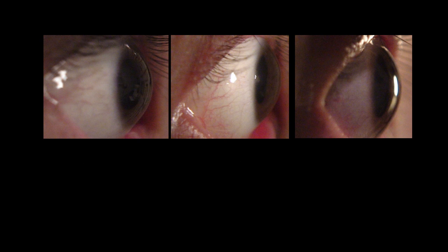Well, clearly, if you look at the central cornea, you'll see that that cornea isn't as prominent as the cornea on the eye to the left or the right, and you'll see that the sclera isn't a steep, curved sclera. So that's the eye that I would choose the 420 sag.